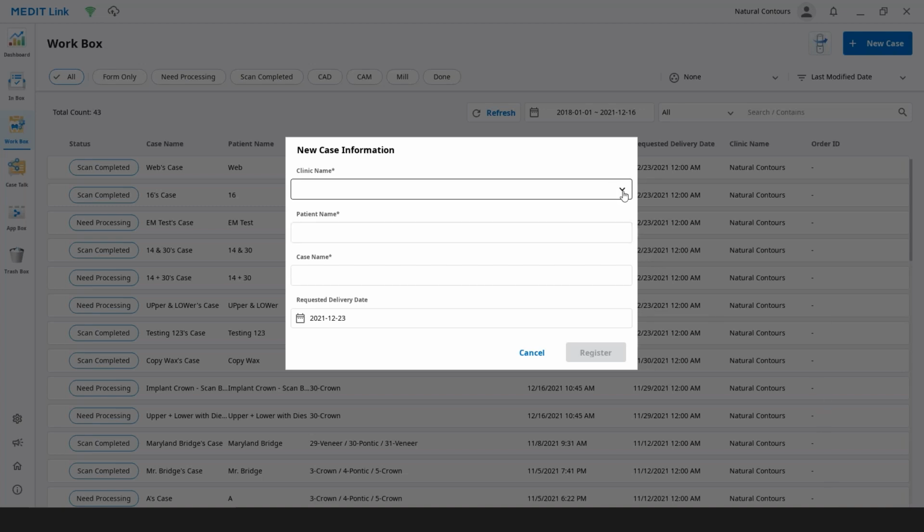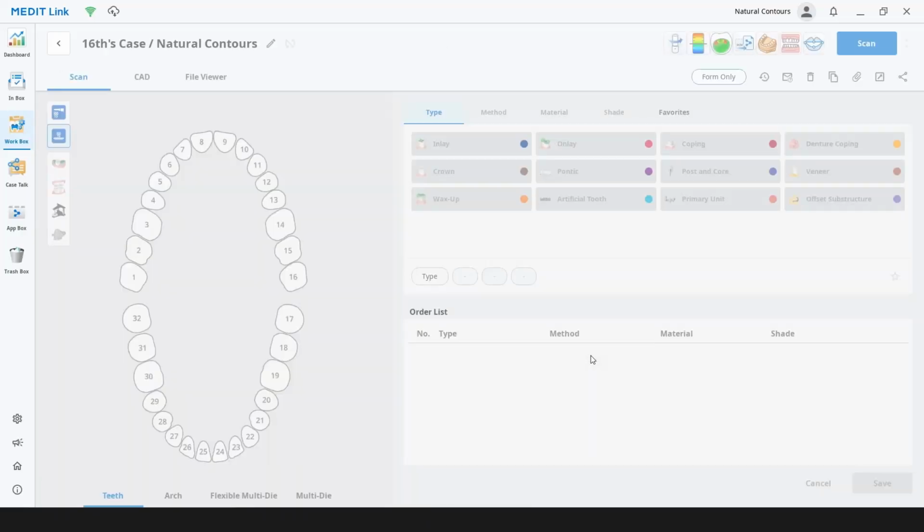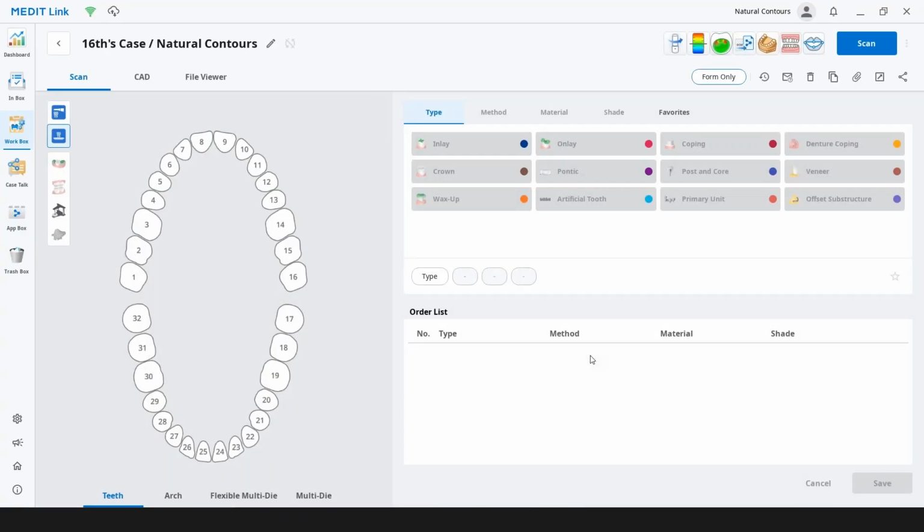So basically, you're going to click and set up your account. You can name it anything you want. Today's date, 16. Just call it 16. And register. Okay, and this is a screen you may be familiar with as well. Some people say it looks a little bit like Exocad. This is where you're going to be setting up your case.